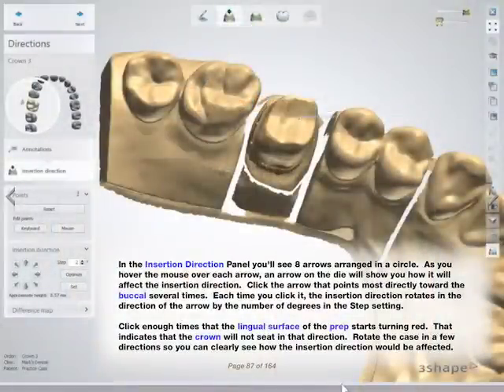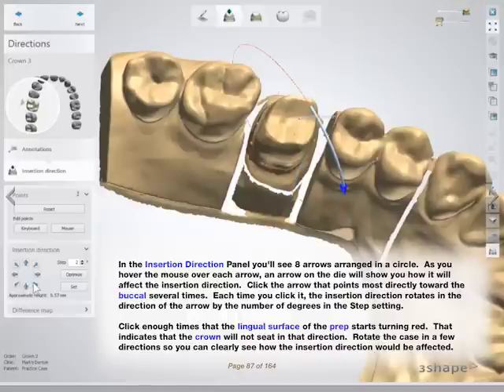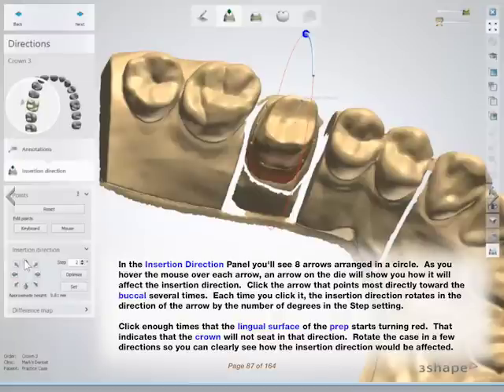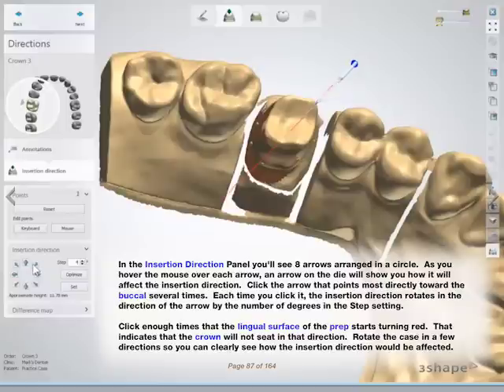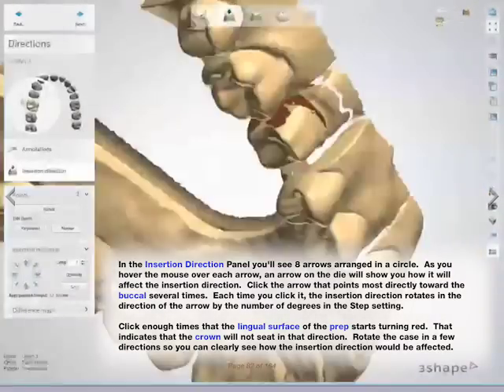In the insertion direction panel, you'll see eight arrows arranged in a circle. As you hover the mouse over each arrow, an arrow on the die will show you how it will affect the insertion direction. Click the arrow that points most directly toward the buccal several times. Each time you click it, the insertion direction rotates in the direction of the arrow by the number of degrees in the step setting. Click enough times that the lingual surface of the prep starts turning red, indicating that the crown will not seat in that direction. Rotate the case a few directions so you can clearly see how the insertion direction would be affected.